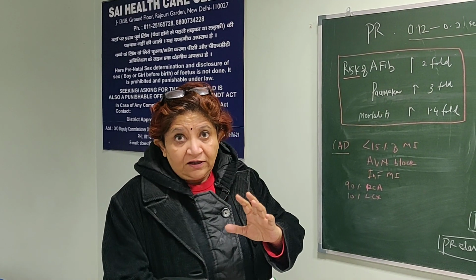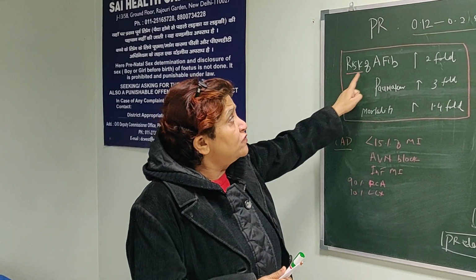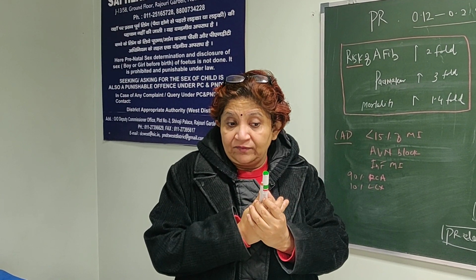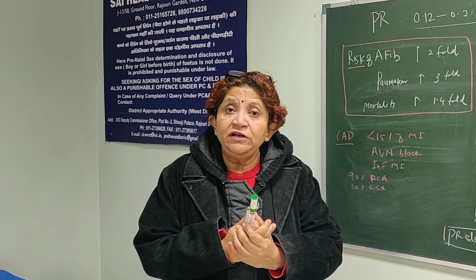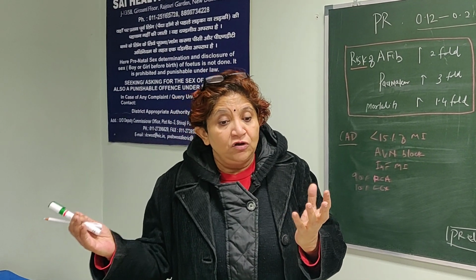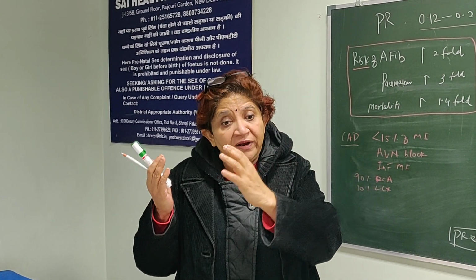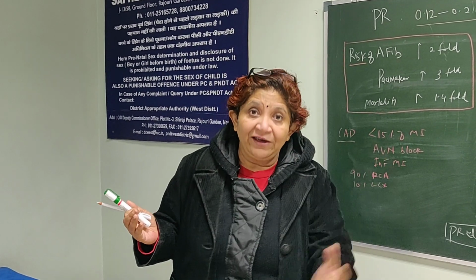It has been seen that if you have a first degree AV block in electrocardiogram, then the risk of atrial fibrillation is increased by 2-fold and the risk of pacemaker implantation is increased by 3-fold, because this AV block, or what we say prolonged PR interval, is a time interval between the onset of atrial depolarization to onset of ventricular depolarization. So the PR interval can prolong due to delay in the atria, due to time delay in the AV node, or due to time delay in his Purkinje system. The delay can occur anywhere.